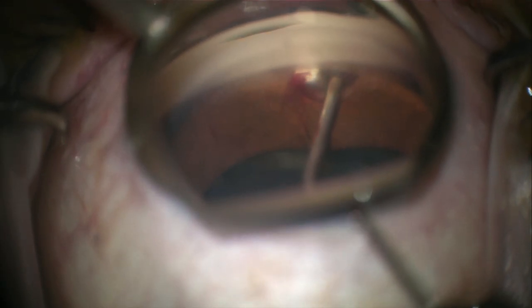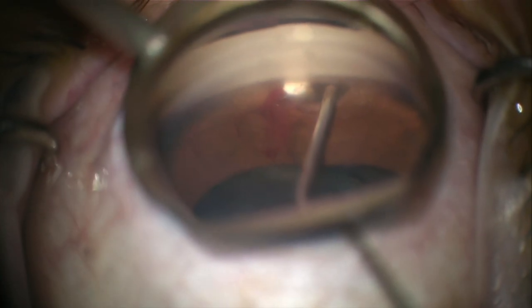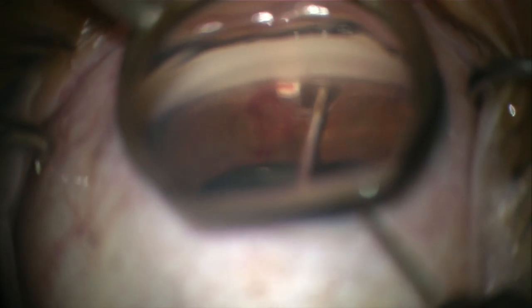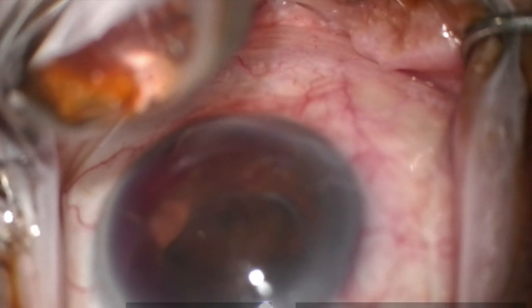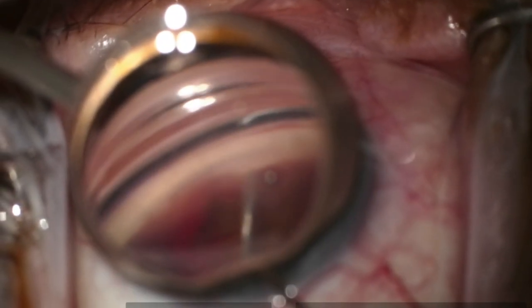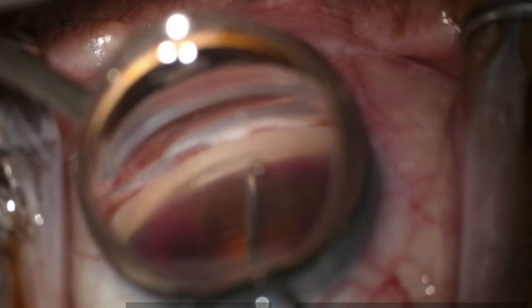Small, self-limited reflux bleeding is common and often expected when entering vascular tissue planes. This type typically clears with irrigation and does not affect outcomes. Concerning heme includes rapid chamber filling, persistent obscuration of angle structures, and loss of visualization during critical steps.